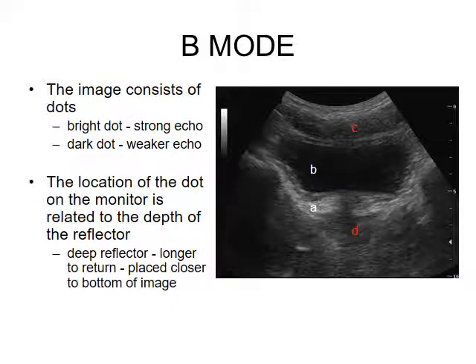If we look at structure D down here, which is actually the prostate, this is a male bladder, so the prostate sitting under the bladder. Structure D, the sound wave has come down and the echo's come back. That one has taken a lot longer to return than the echo from structure C. So the body goes, okay, that bit of anatomy is actually deeper in the body, further down from the surface, and therefore put deeper on our image.